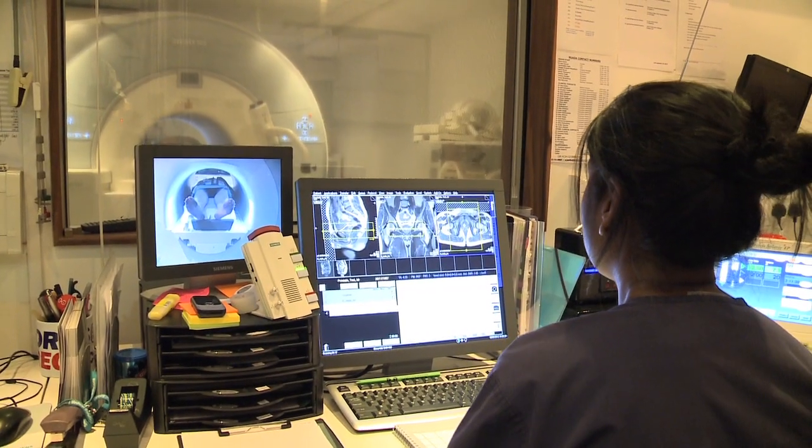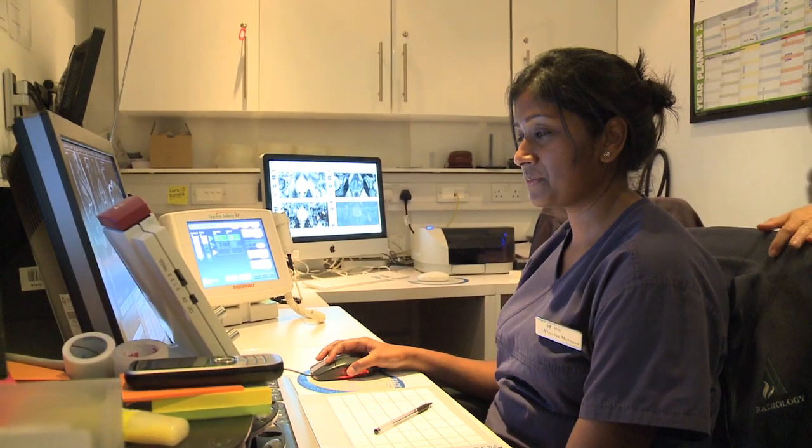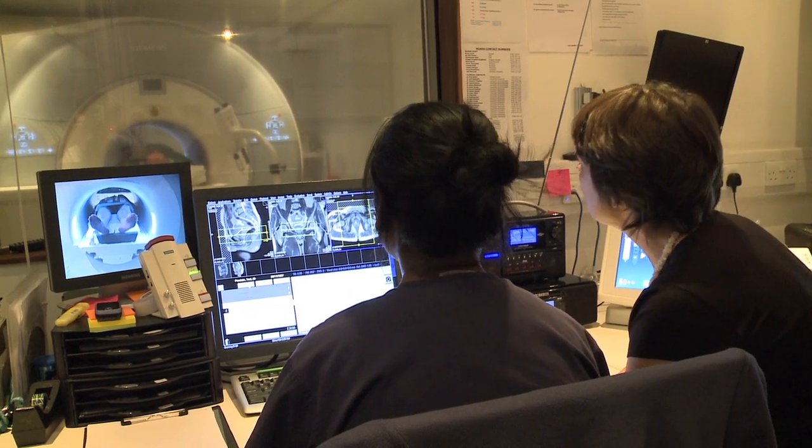I think the big change has been the advent of MRI and its use in prostate imaging. What we've had in all other parts of the body is an ultrasound technique or indeed a CT technique which has allowed us to tell whether someone's at risk of getting cancer. And in fact, prostate has fallen behind many other cancers and many other organ systems. We're only just now realizing techniques that we use for diagnosing lymphoma and breast cancer can now be used to diagnose prostate cancer. So the great revelation, really, has been the fact that we can now see prostate tumors.